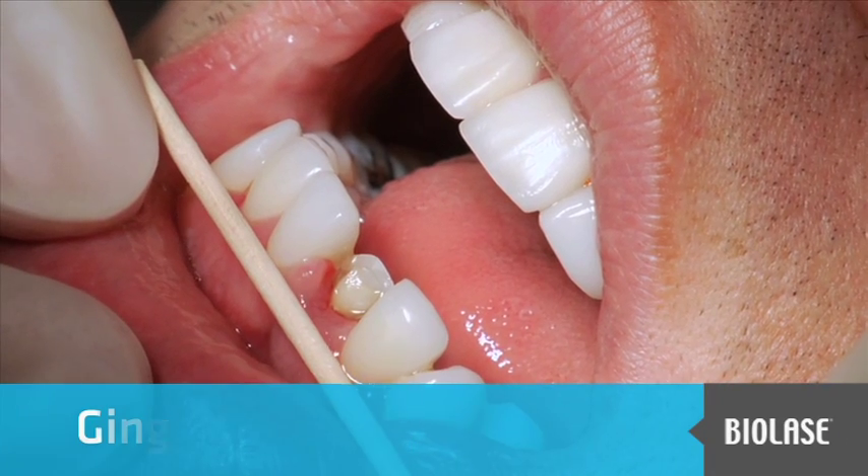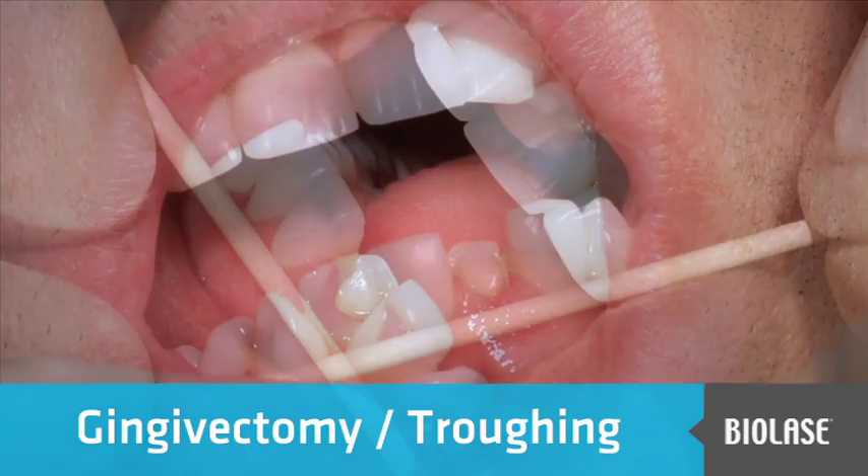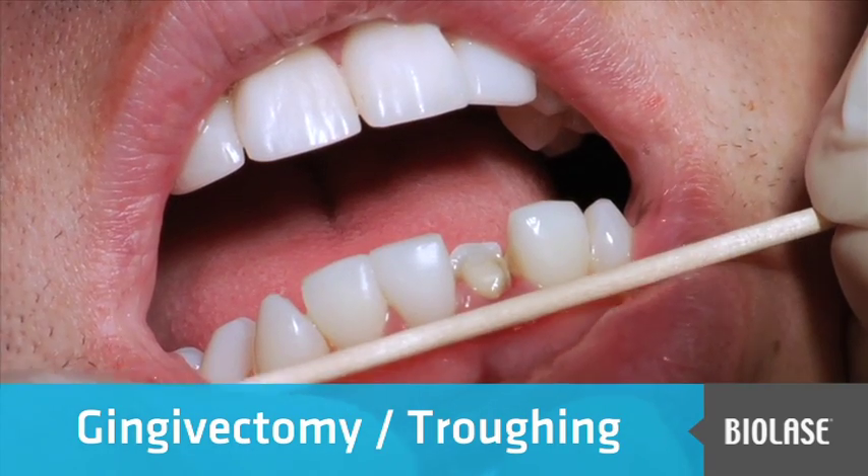In this presentation, we have a young man who dislodged a veneer on tooth number 24. What we can see here is that the tissue has just grown back up over the margin.